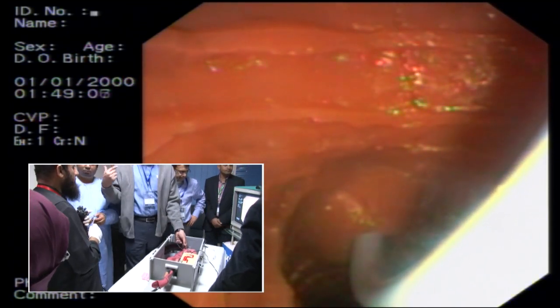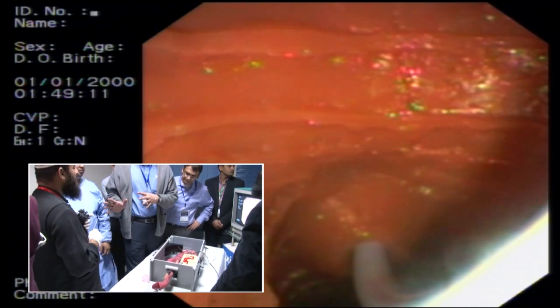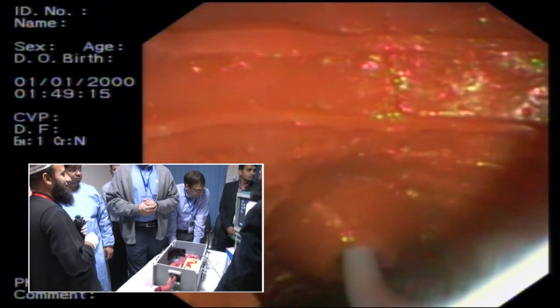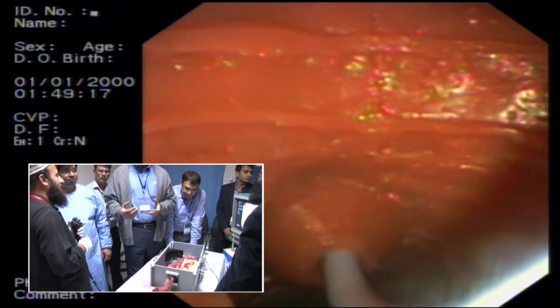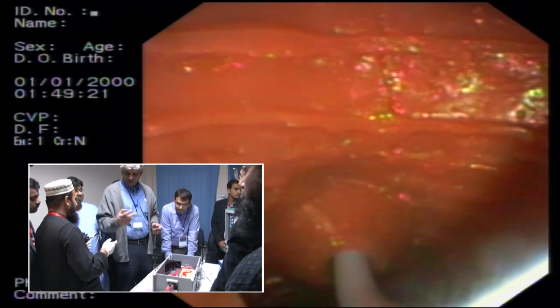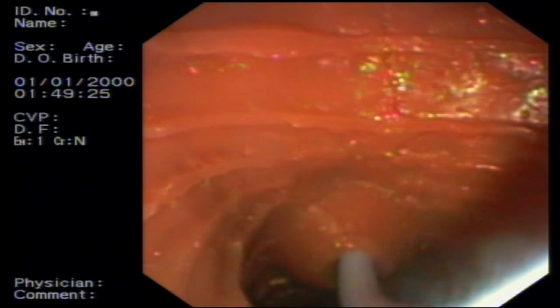You see, there is no communication. You have a new tech who doesn't understand you. You don't understand him. You've not communicated with him. You need to understand. You say, यार मैं अब आप थोड़ा pull back करो. Guiding catheter pull back करो. Stent अंदर डालो. तो आपको एक वो तो होना चाहिए ना. ठीक है ना?